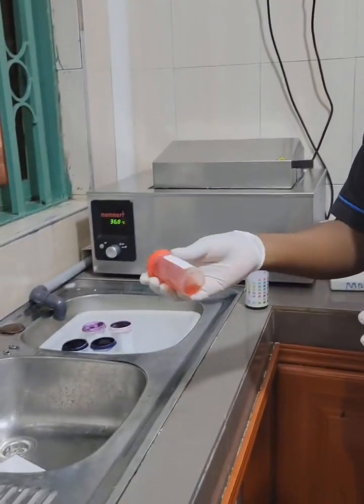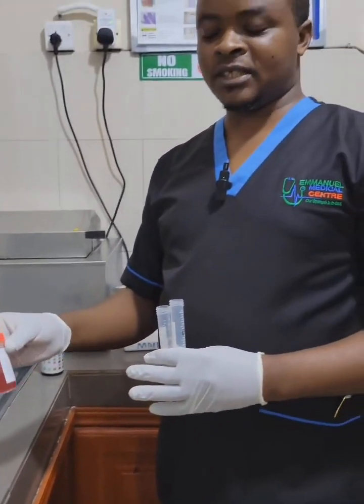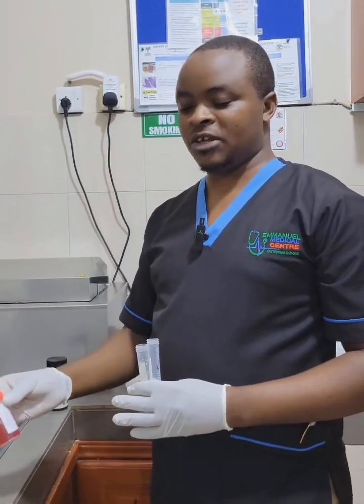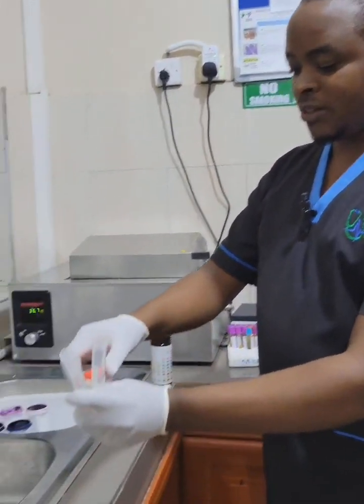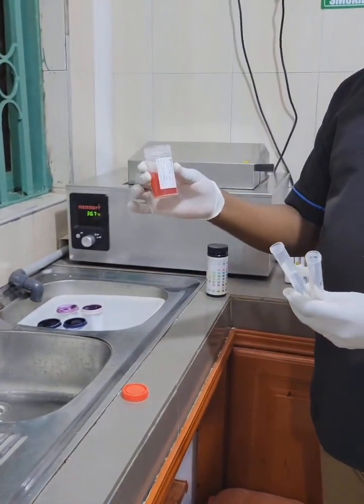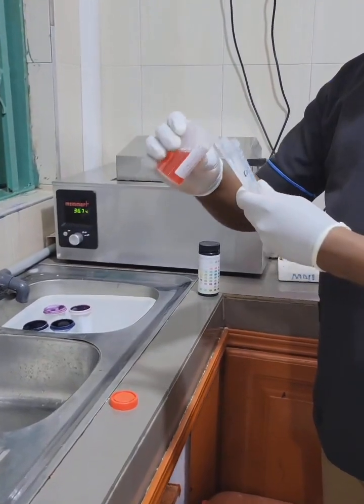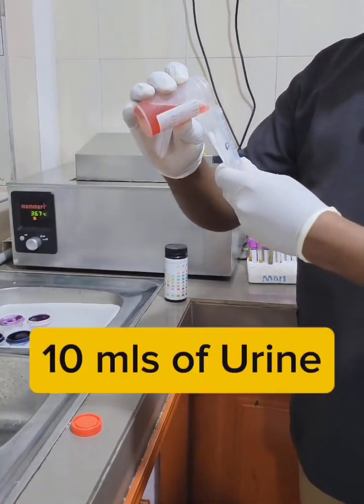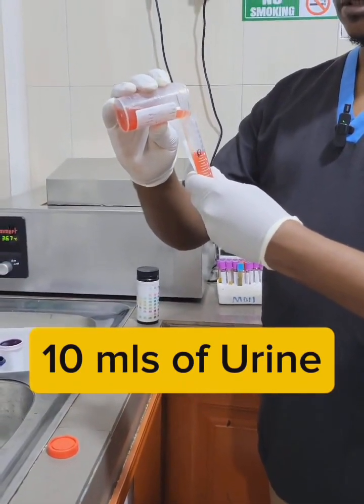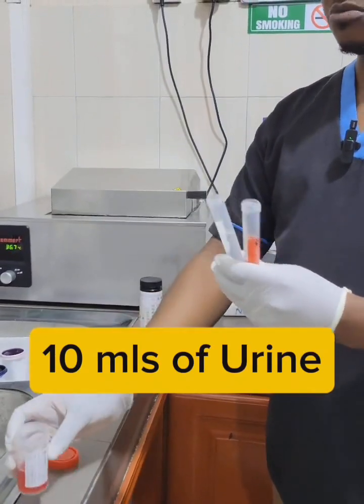So what you do, you first mix the urine well, so that if there are sediments, they are evenly distributed. Then after mixing the urine, you open the urine container, which is labeled with the patient name. Then you add at least 10 ml of urine collected from the patient into a centrifuge tube.